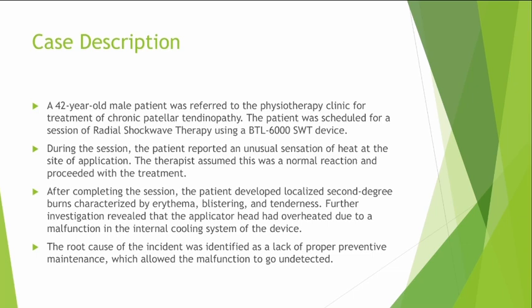Okay, so it's very clear now. The patient comes to the physiotherapy, he wants to take a treatment of chronic patellar tendinopathy, and the therapist used the radial shockwave therapy on this patient. During this session, the patient reported an unusual sensation of heat at the site of application.